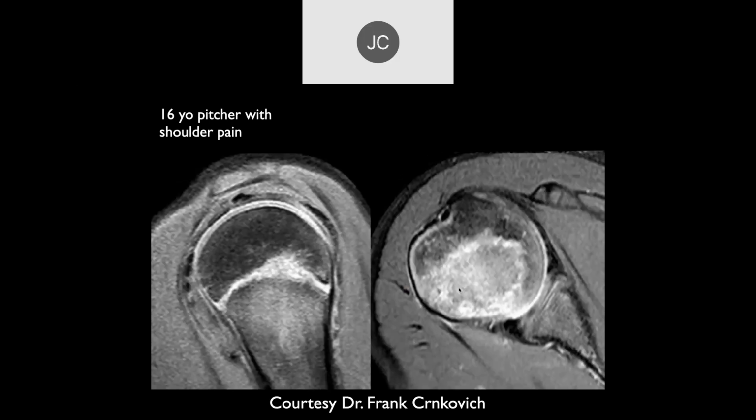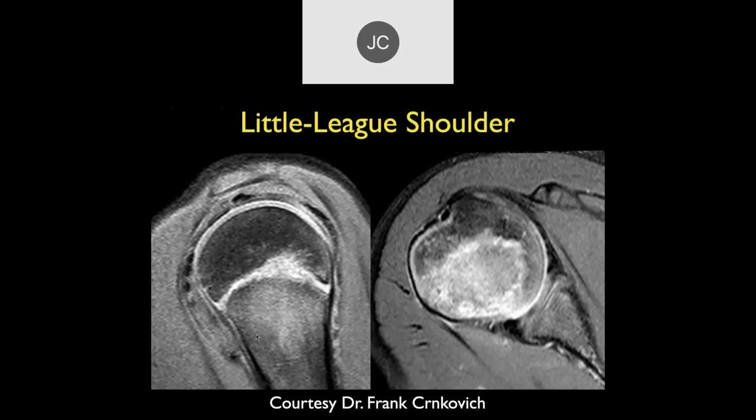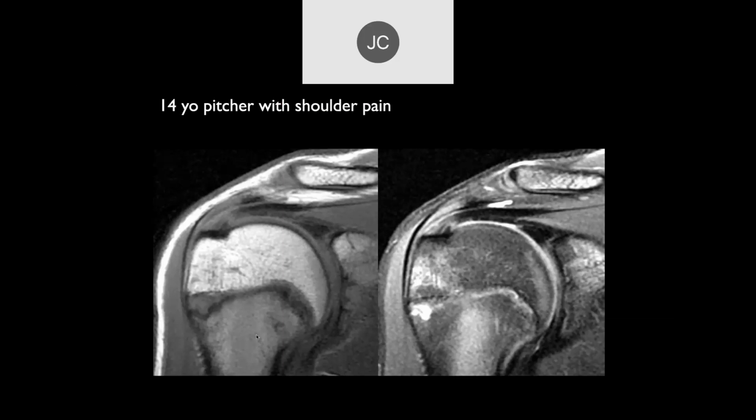And then here are other images. Sometimes this can be a little bit subtle. You want to pick this up before you have gross findings. But the clinical history and then this appearance of the irregularity of the growth plate here with a little bit of edema going into the epiphyseal region, that's really not normal. And this was another patient who had a little league shoulder. Okay, Pavan? So we see some edema and widening at that lateral aspect of the physis, and then there's a little bit of edema in the epiphysis as well at that lateral aspect.